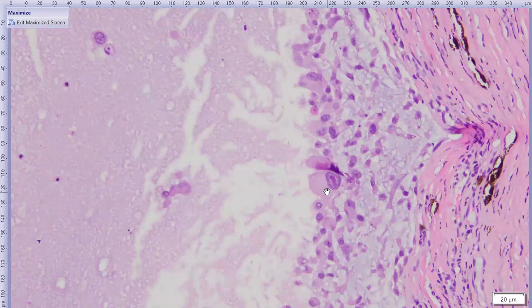If you were unsure that this was neoplasm or neoplasia, you can take a look at the cell, which is huge with a giant nucleus and a really giant distinct nucleolus. We have a sort of round cell population, but then often in areas like this, they sort of become more spindle or almost stellate shaped. So there's some significant variability in the cell shape and size.